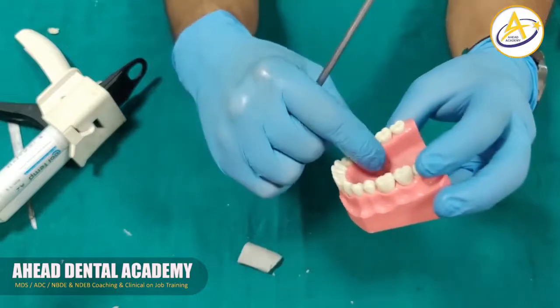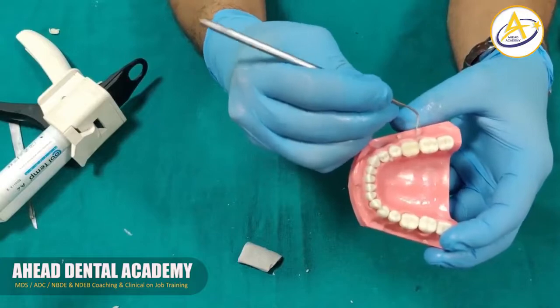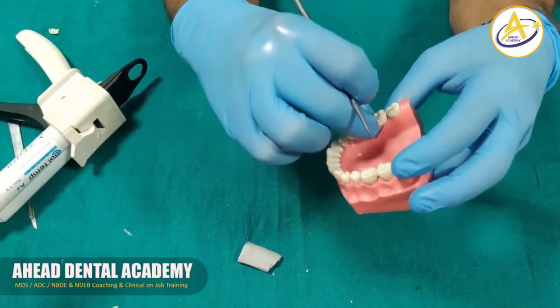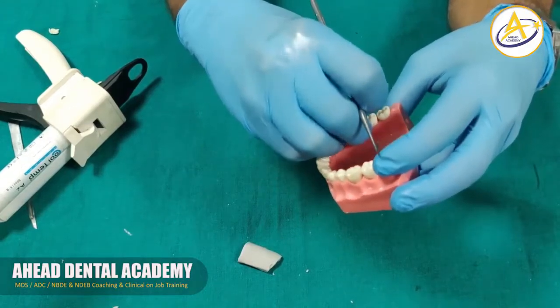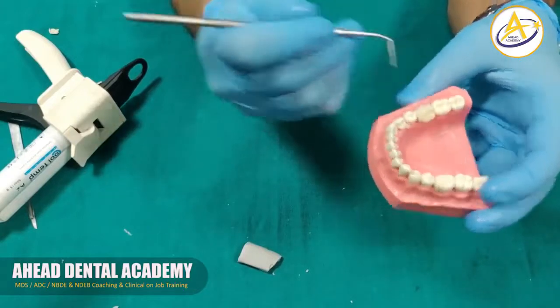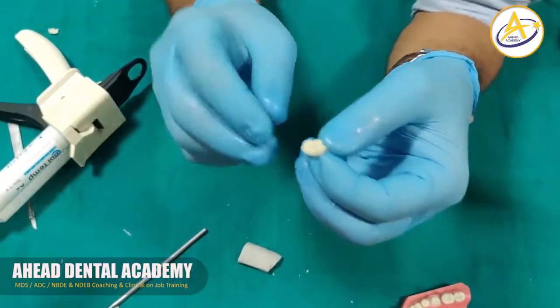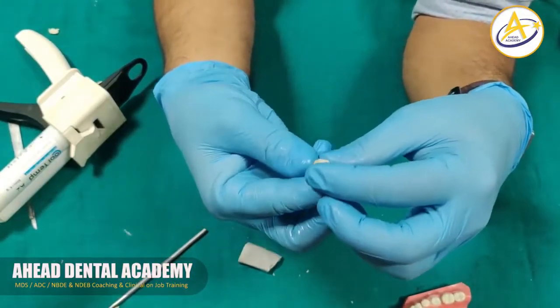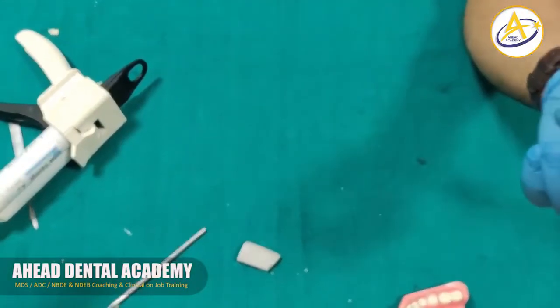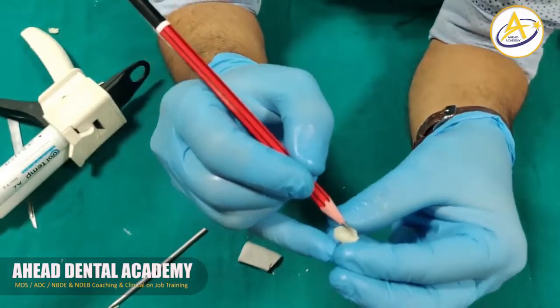We remove this temporary tooth that has been made, and you can see that the shape of the tooth is according to our natural tooth that was obtained. This is the tooth that has been formed. We mark the margins using a pencil.